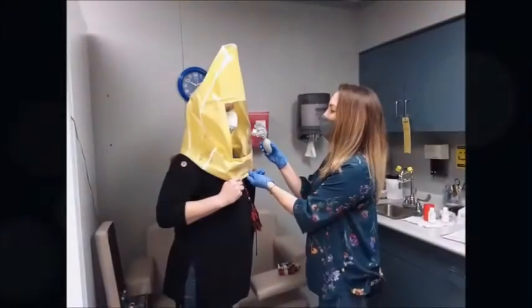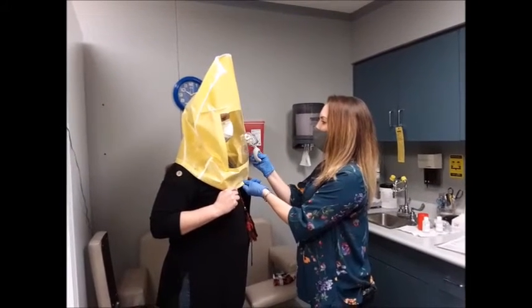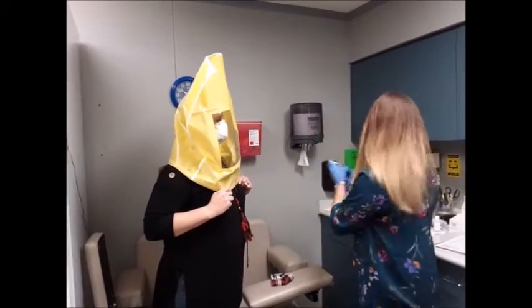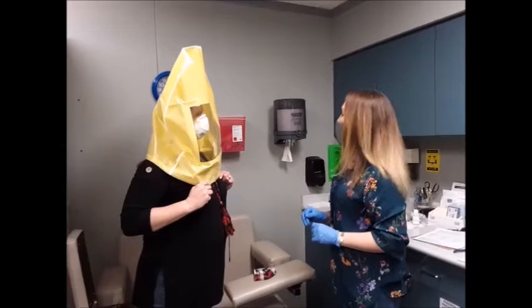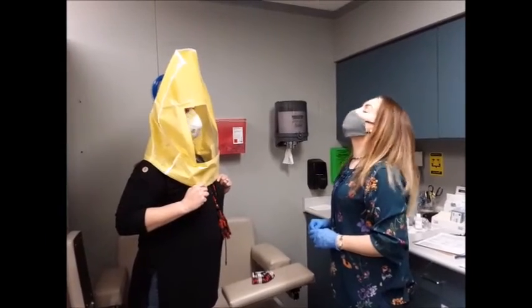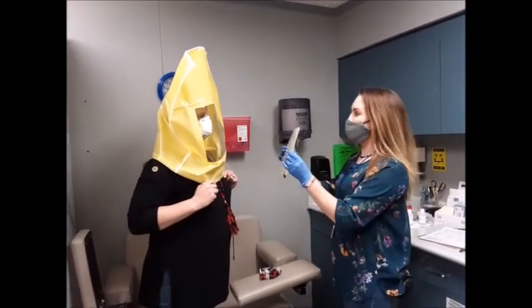Let me know if you taste or smell anything bitter or sweet. You don't taste anything? Okay. I'm going to have you turn your head side to side. Open your mouth. Up and down. Anything? No. Okay.